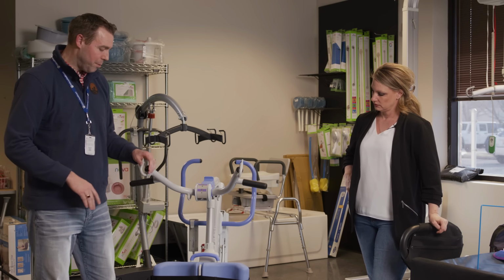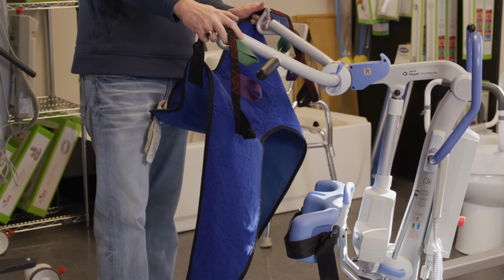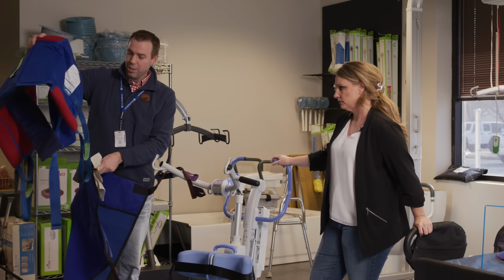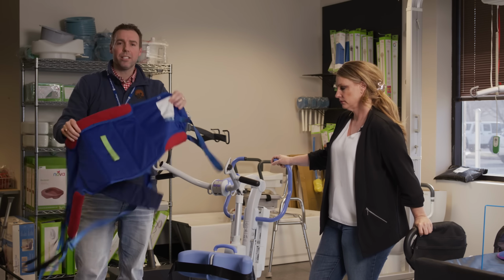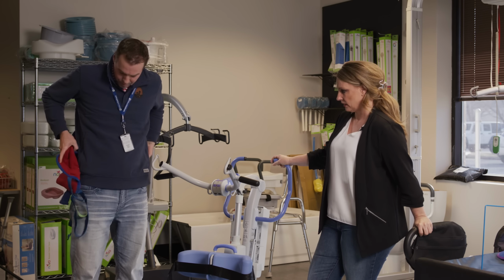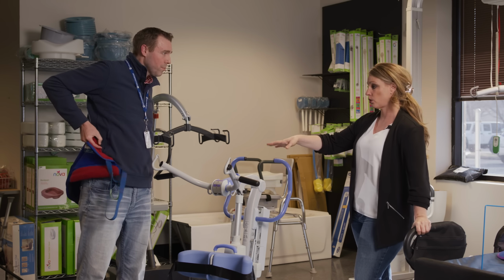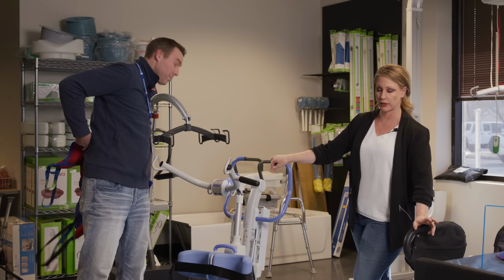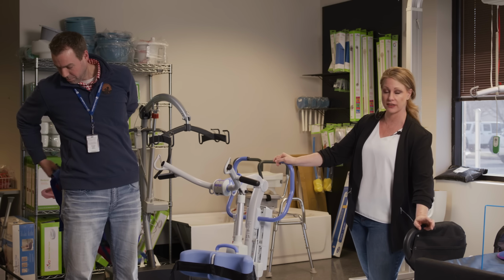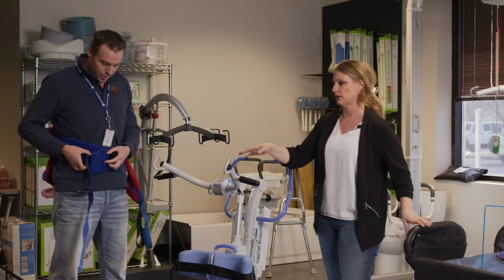So this one actually comes with a sling. There are a few different options that you can use with this lift. This one is just going to go around your waist. It seems to me when Matthew and I were using a sit to stand, this was a quick alternative, especially because he could still bear weight. We didn't have to go to the Hoyer lifts right away. The Hoyer lift can make some families with ALS feel claustrophobic or like they're kind of tucked in. So this is a great alternative.